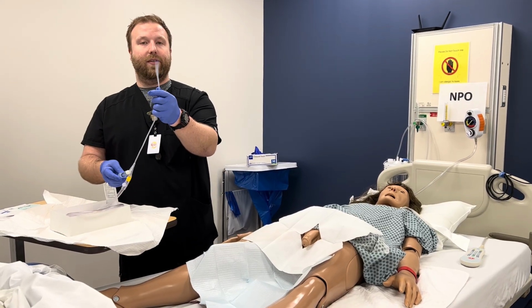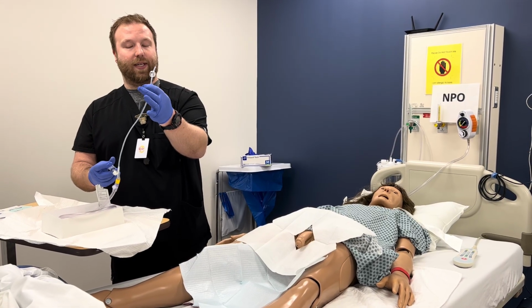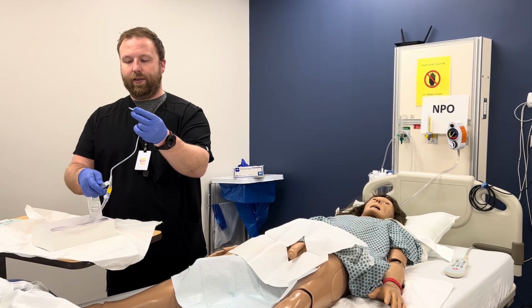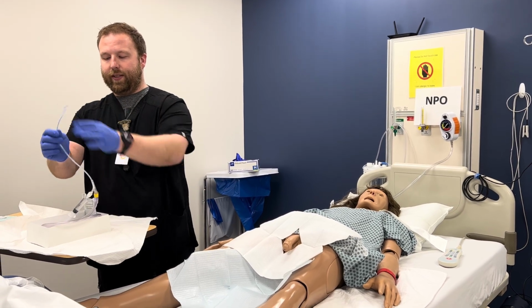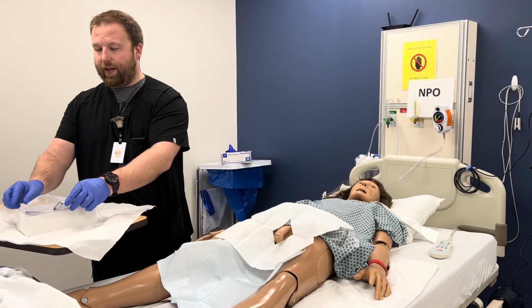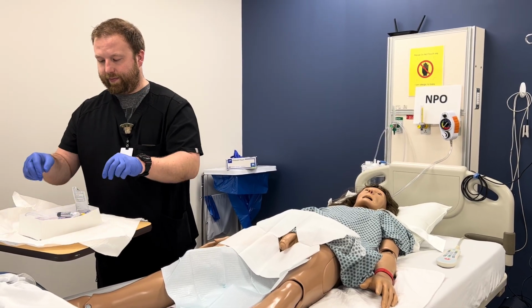You're not supposed to inflate the balloon before you stick it up, but I do like to show this is what happens when you inflate your balloon. This is what keeps the catheter inside of the patient. But you want to make sure that your syringe is attached before you insert the catheter. I will set this in the lubricant, and then I'm going to position my catheter in the box here.